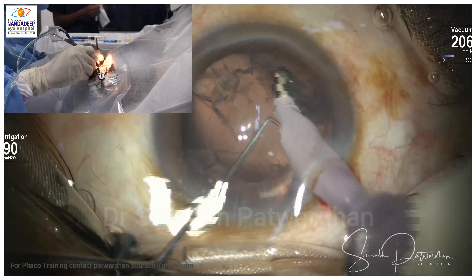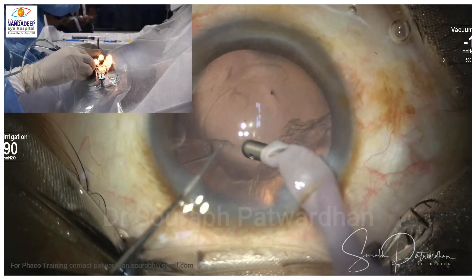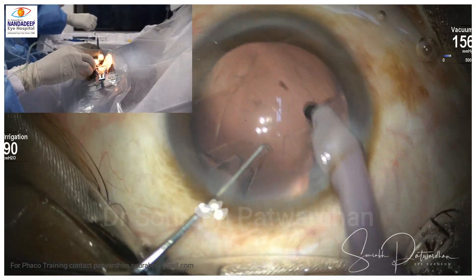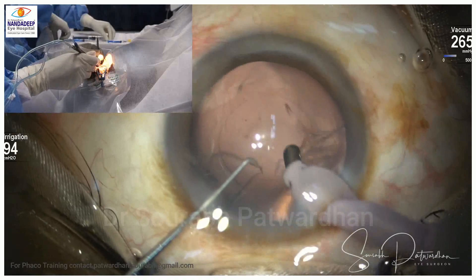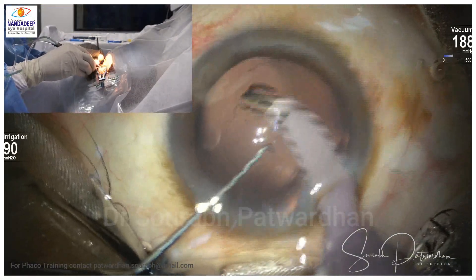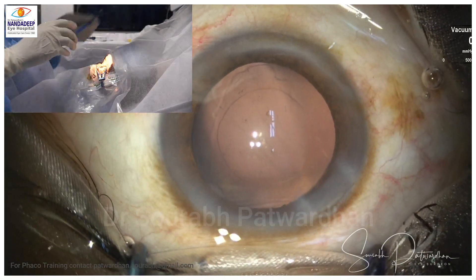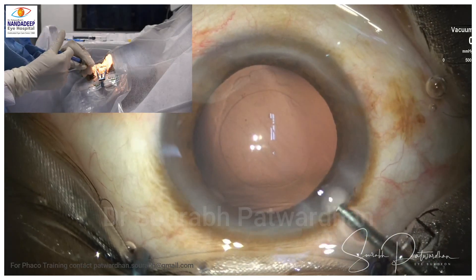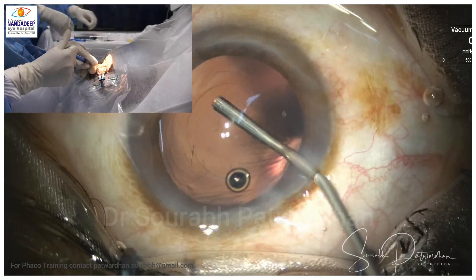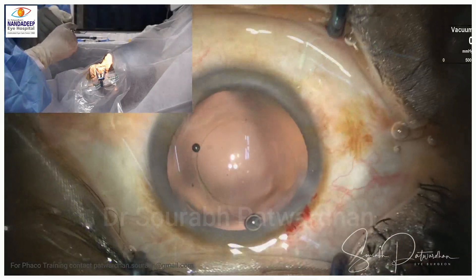You need a stable probe inside the anterior chamber, which is very important. The same is true for your non-dominant hand — whether you're using a Sinskey hook or a chopper, that hand should be similarly rested. If you are having difficulties with stability during certain maneuvers, always ask someone to take a video of your hand position during different steps and compare it with this video to find and correct issues.